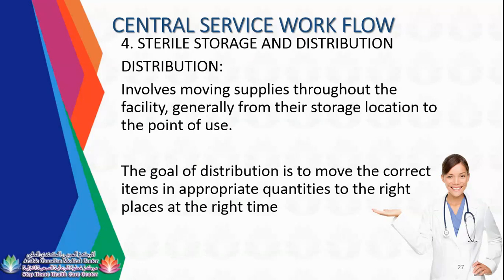For distribution, guys, you need to remind your nurses and physicians that there are specific turnaround times in every procedure, in every sterilization process, because there are times that we are rushing on the need for the instruments. For example, they send your instruments at 3 p.m. and they want the same instruments at 3:30. Is it possible? No, it cannot be turned over in just 30 minutes. The whole process in CSSD might take a minimum of 1.5 hours. So 1 hour and 30 minutes minimum.